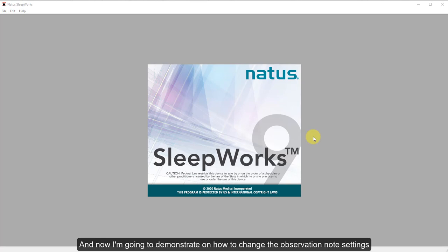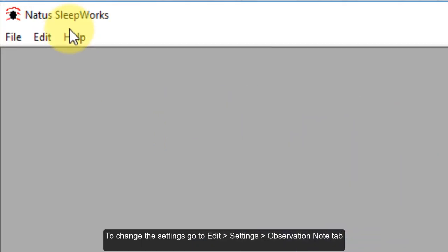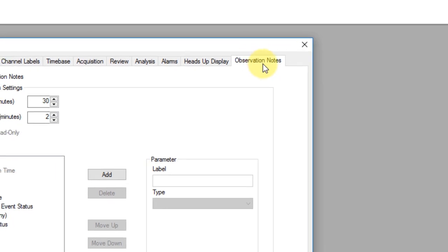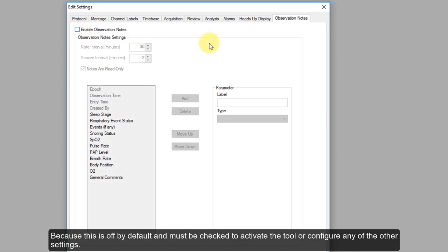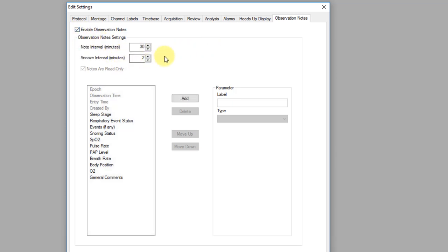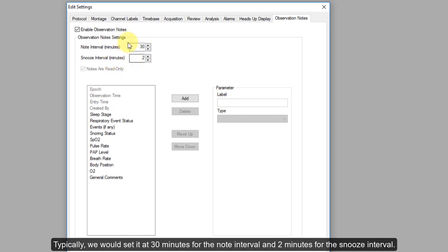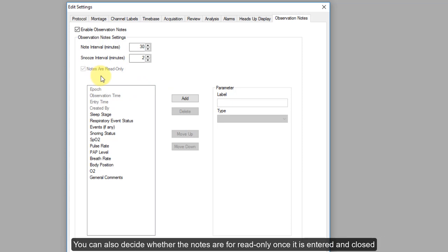Now I'm going to show you how to change the observation note settings. To change the settings, you need to go to Edit, then Settings, and then choose the Observation Notes tab. In the settings dialog box, it allows users to enable observation notes — this is off by default and must be checked to activate the tool or configure any of the other settings. After that, you can set the note interval and the snooze interval in minutes. Typically, we set it at 30 minutes for the note interval and 2 minutes for the snooze.